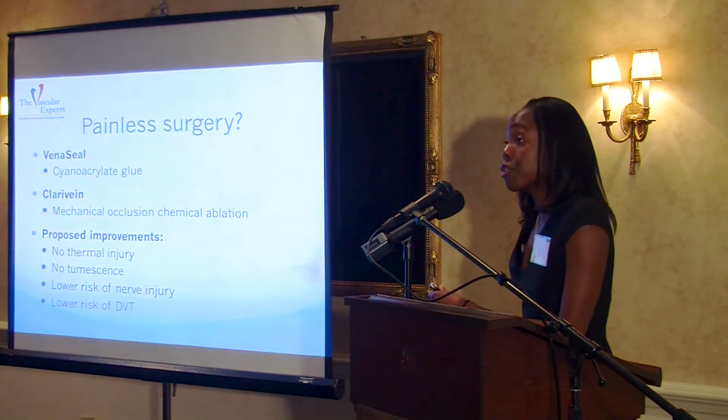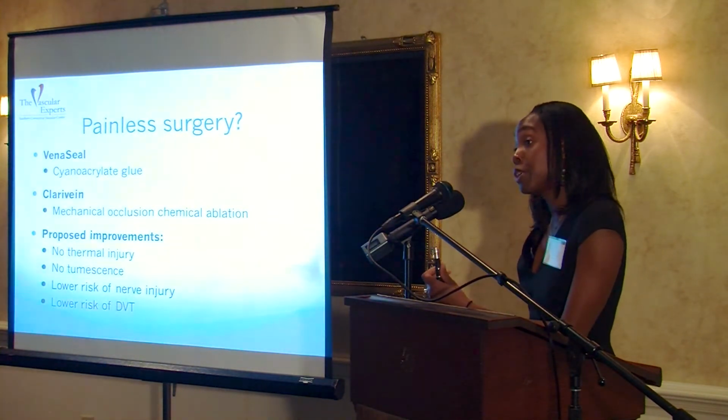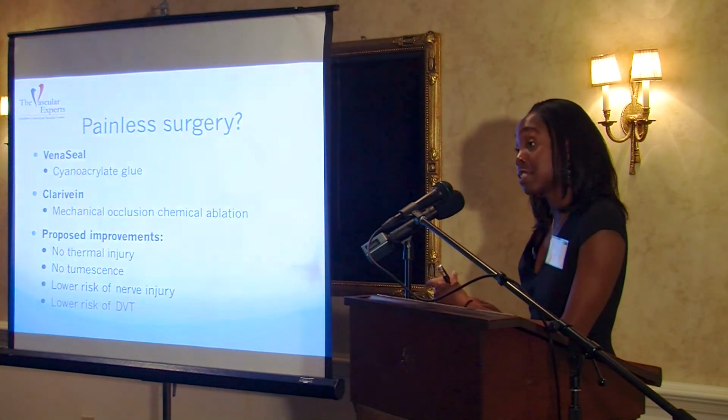So the things that are a bit on the horizon are sort of touted as possible painless surgery. What is key about these is that, similar to sclerotherapy, they do not require tumescence. So the first, the trade name is VenaSeal, and it's essentially a surgical glue. So it's cyanoacrylate glue. The procedure is again percutaneous. It's again performed under ultrasound guidance, but it does not require any tumescence. And the glue is then infiltrated into the vein, allowing again that fibrosis and thrombosis. This is now FDA approved and becoming available in the US. It's available in Europe currently.